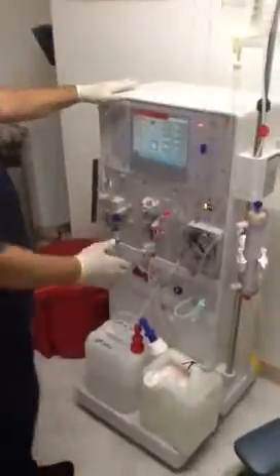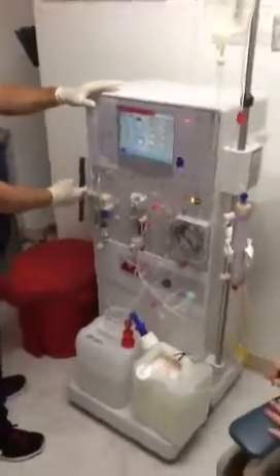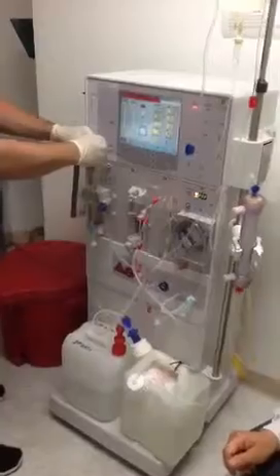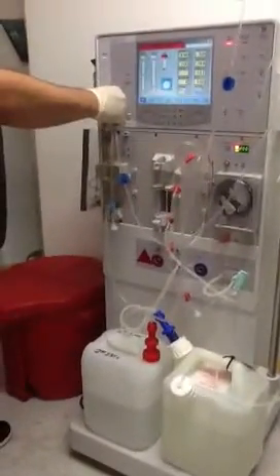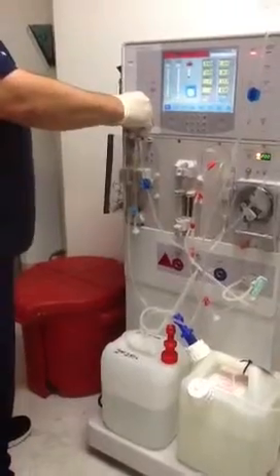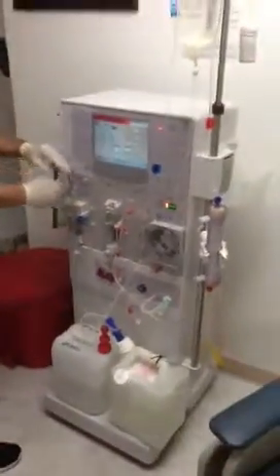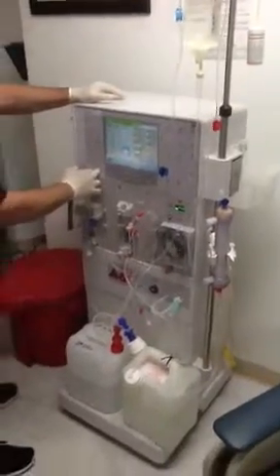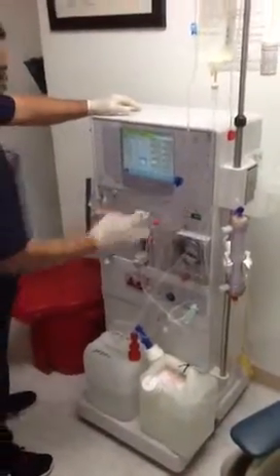Clean your saline line. Now we're going to work on the venous side — we're going to fill the venous drip chamber. Loosen the cap, fill it up to the bubble trap, then clamp it. Push reset for green lights. We have green lights. Stop the blood pump.